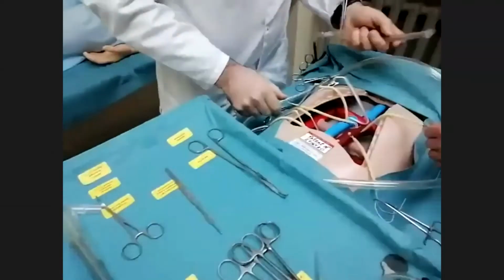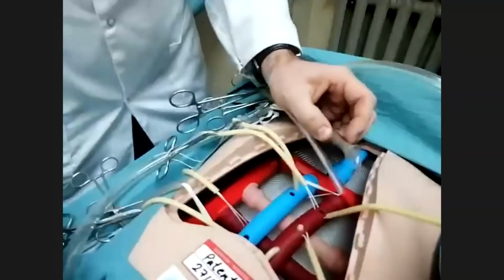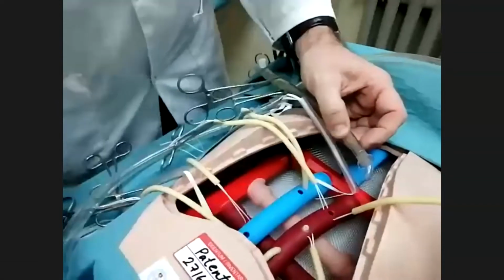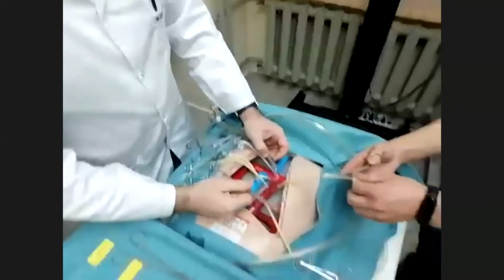Then I take the cannula for the aorta, watching the monitor, and it's important to see the level of blood pressure.